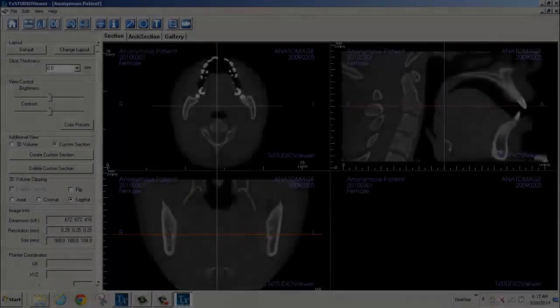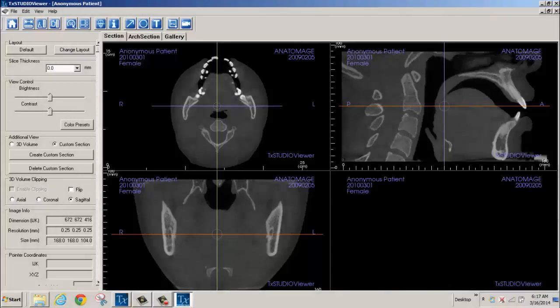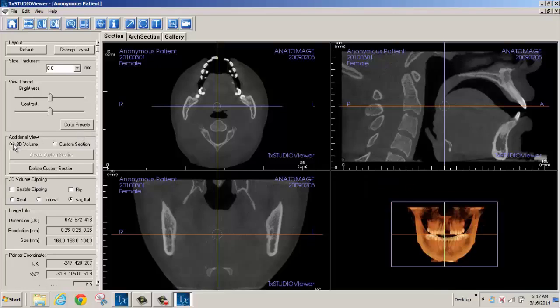Once a case opens in Treatment Studio Viewer, you'll be given three option tabs. The first, the Section tab, will give you the opportunity to see 2D slices or you can see 3D volumetric sets.